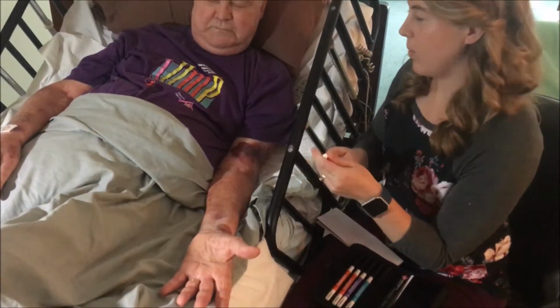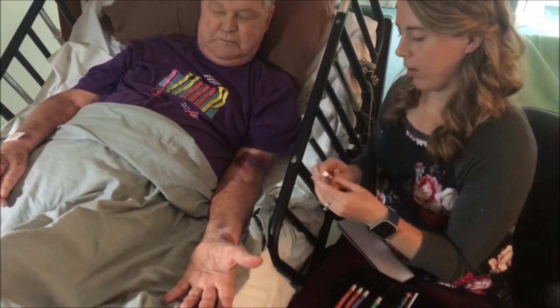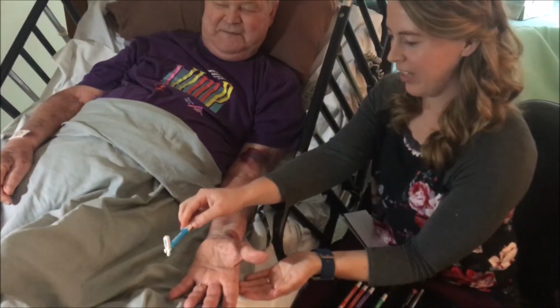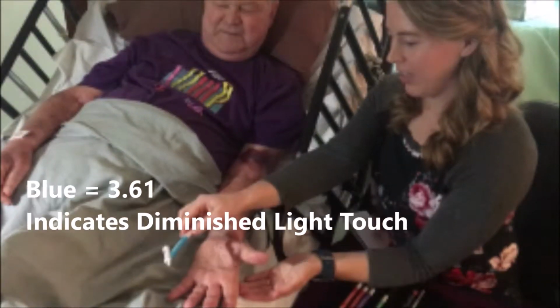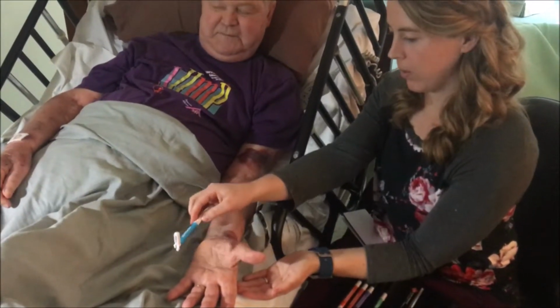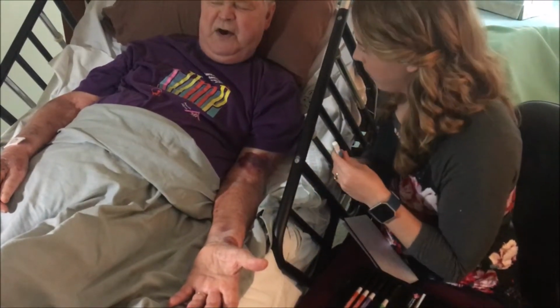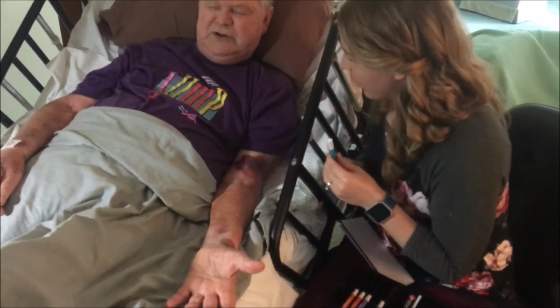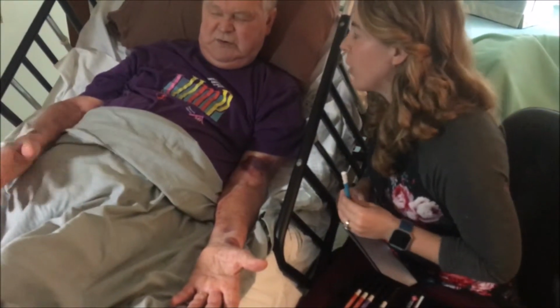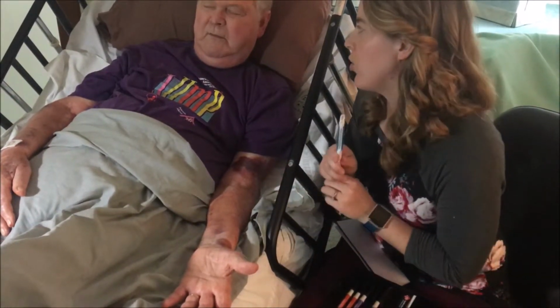Okay. So that was the light pressure one. Did you feel anything? Nope. So I'm going to go to my next one. Keep your eyes closed. You're doing a great job. Did you feel anything that time? I thought I felt a very slight touch. But you didn't say anything. I didn't know what to do. That's okay. So I'm going to do this one again. Whenever you feel that really light touch, say touch.